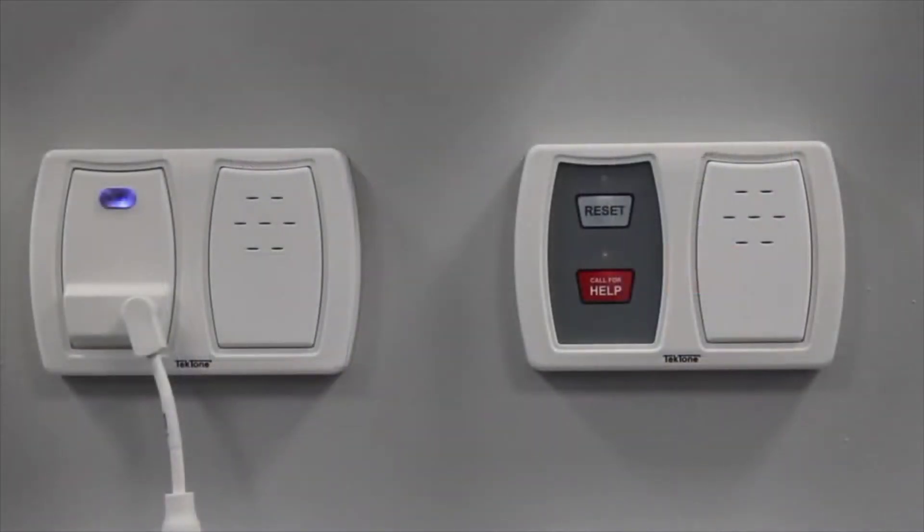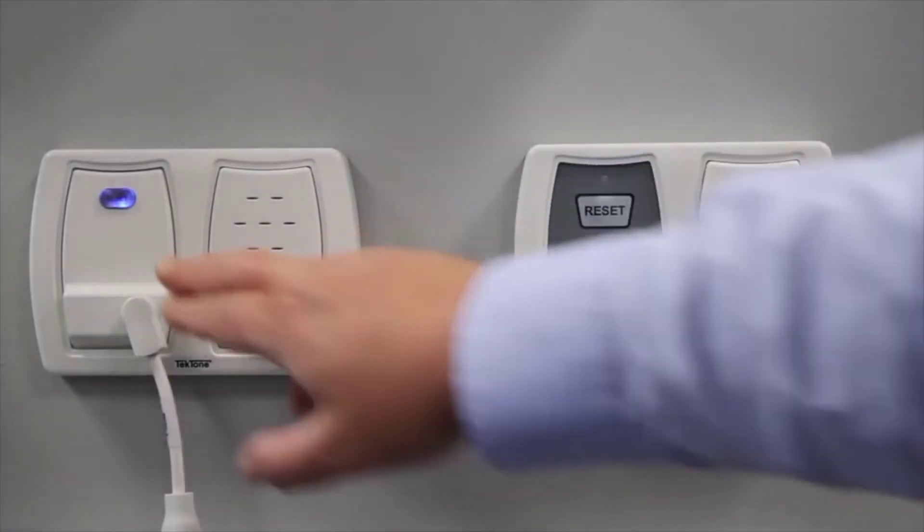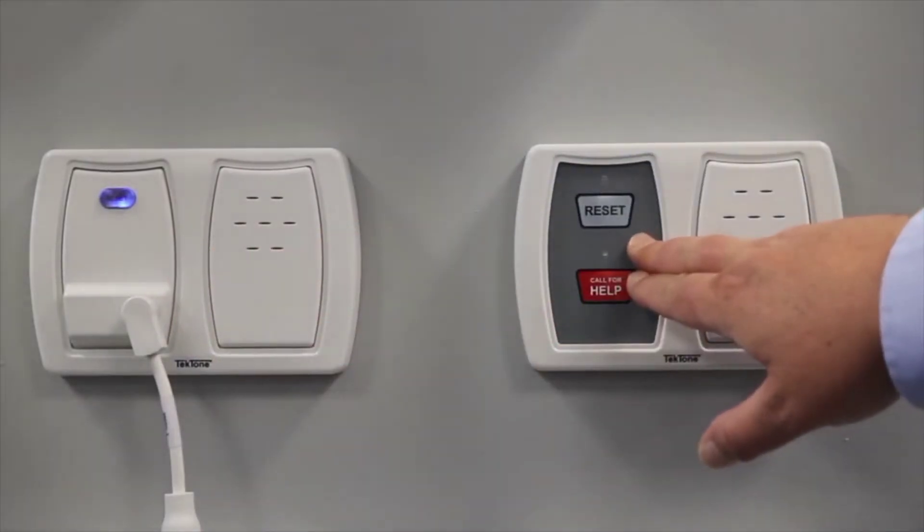Our speaker station can be used to add audio when used in conjunction with our patient station or our two-button customizable peripheral device.